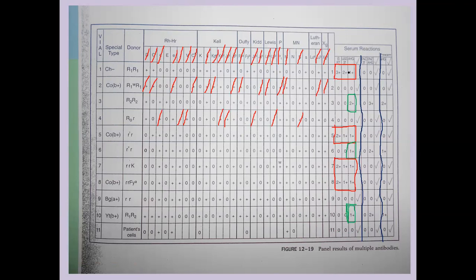Okay, so we have a couple things left. So let's look at first big E. Okay, big E. The first two cells are negative for the antigen. Patient reacted here, but not here. So one of them fits and one of them doesn't, but let's just keep looking, okay? Positive was cell 3. Okay, that fits. Then we have two negatives. Well, one negative fits, but the other one doesn't.